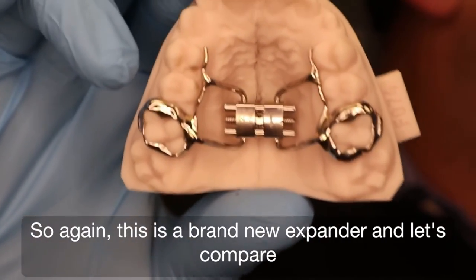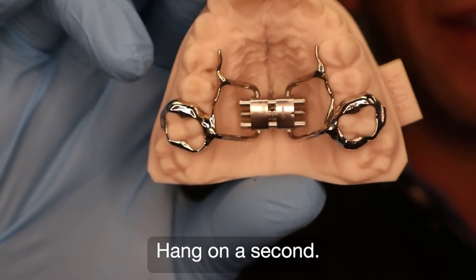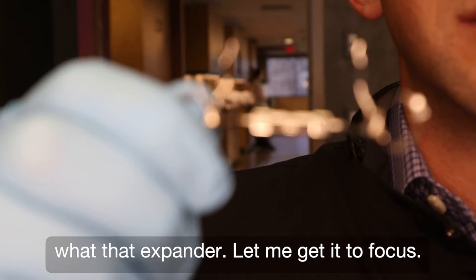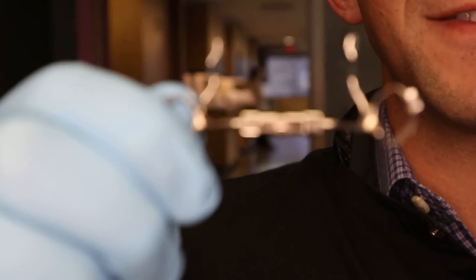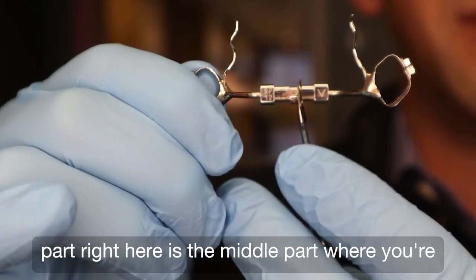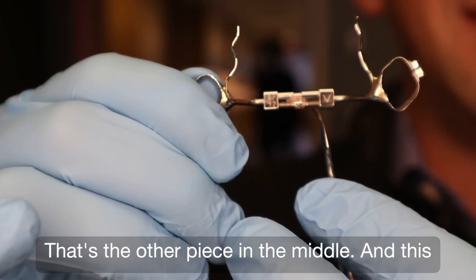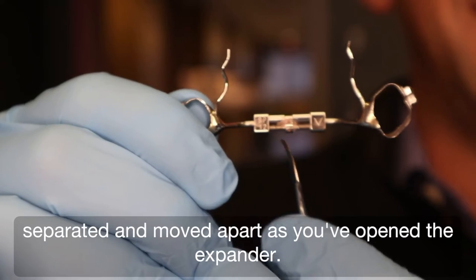So again, this is a brand new expander. Let's compare this with the next one, which is fully opened. So this different design expander — this is what that expander looks like after it's been opened. This part right here is the middle part where you're doing the turns. That is one of the pieces in the middle, and that's the other piece in the middle. And this section right here is where the two sides have separated and moved apart as you've opened the expander.